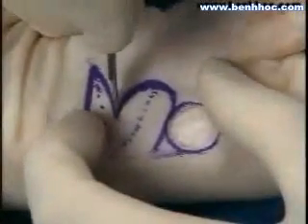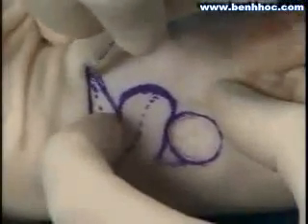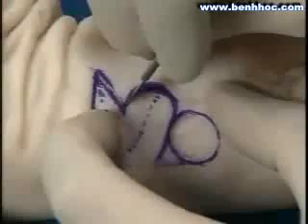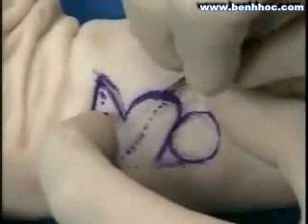Here you can see the lesion has been excised, and now the limbs of the second flap are being incised. The first flap is now being incised, and that's more circular because that needs to be rotated into the area of the defect.